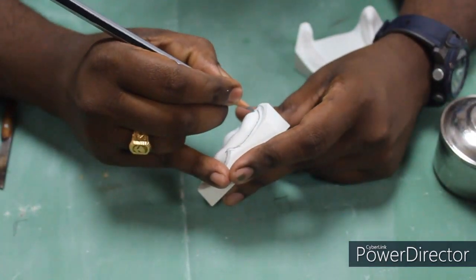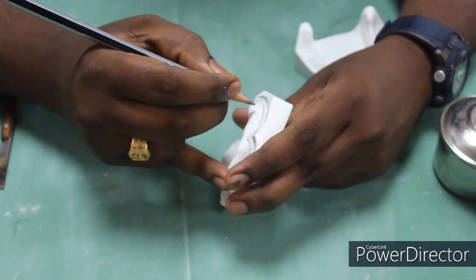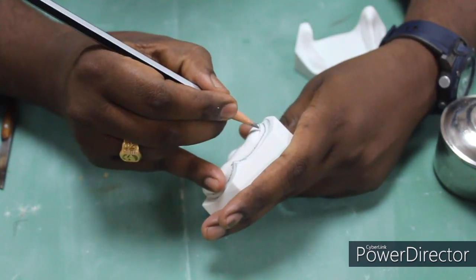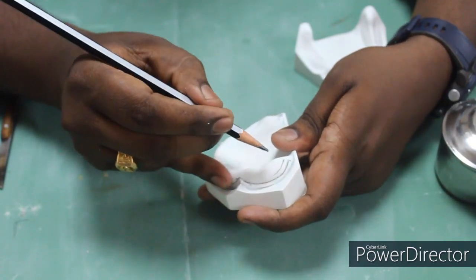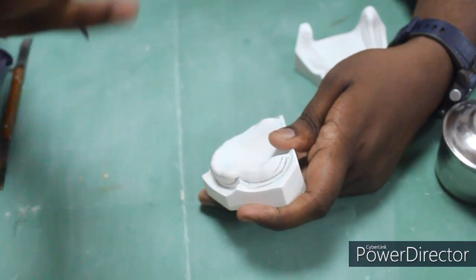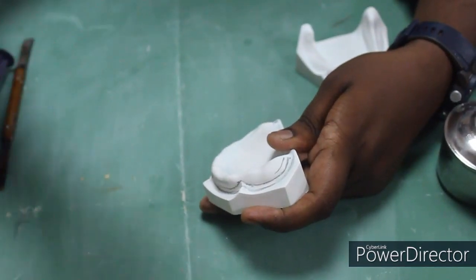That will be 2 mm from the proposed tray line, so it will be almost 4 mm short from the depth of sulcus. If you notice here, this spacer line will be 4 mm short from the depth of sulcus.